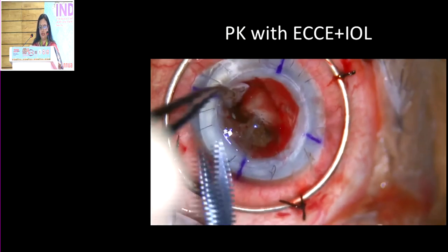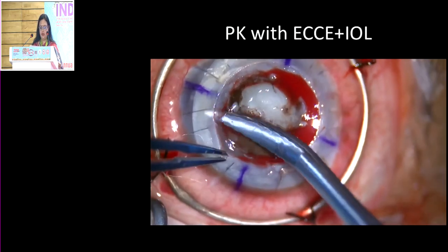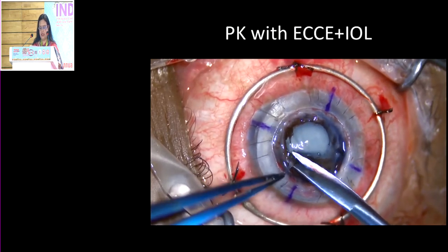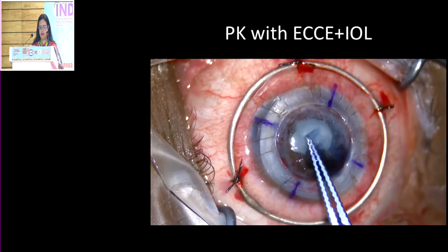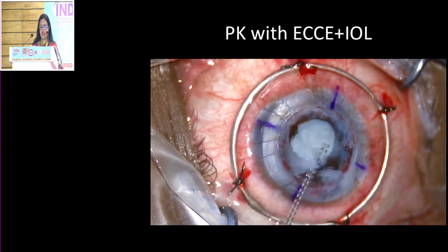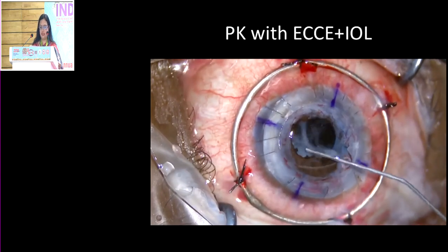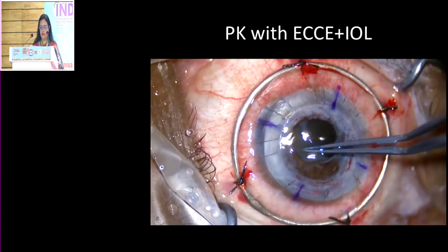As I expected, there was a mature cataract underneath. It's important to release the peripheral anterior synechiae (PAS) all around — use a high-density viscoelastic, go all around and release the PAS. I prefer to do a capsulorhexis as much as possible; if I get a good rhexis, then I can definitely insert the lens in the bag. That is a lot safer than putting it under the iris, particularly with this damaged iris.